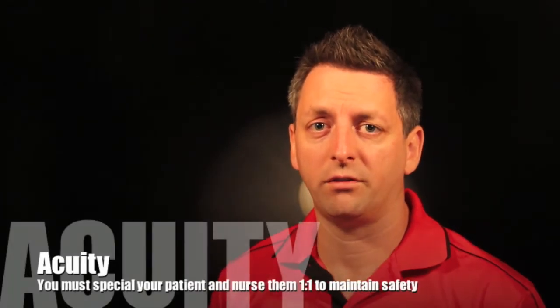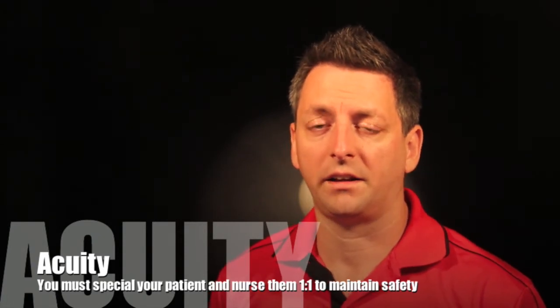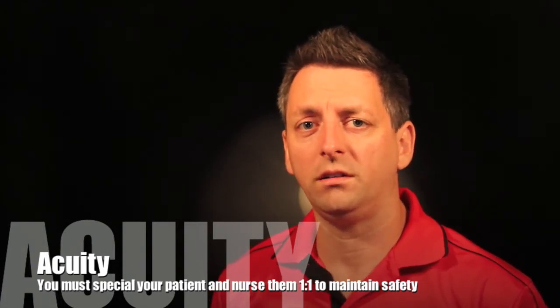When a patient is on non-invasive ventilation, and if they are quite ill with it, you need to be with the patient all the time because of the risk of aspiration or the patient deteriorating suddenly. So it's one-on-one nursing, and it's very intensive.